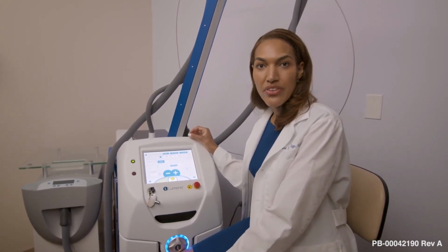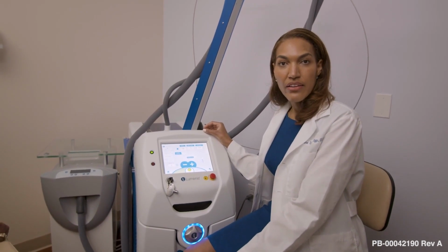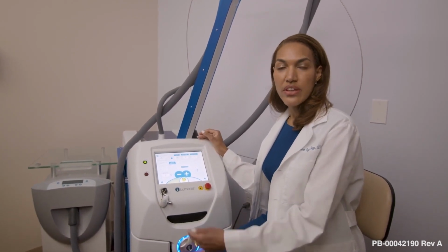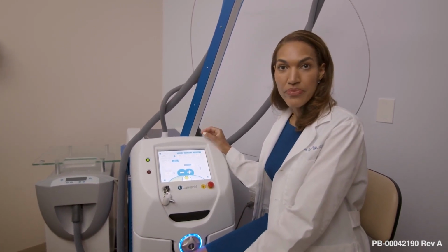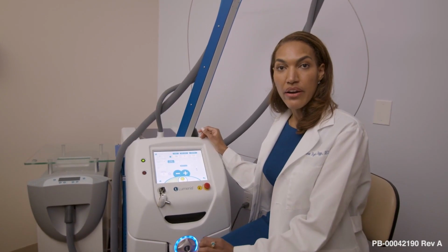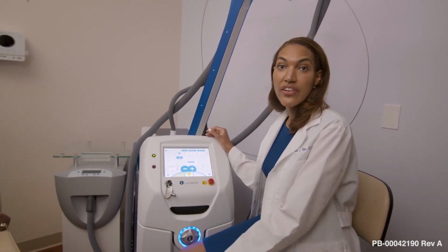So many times it can be difficult to see inflammation in the skin of someone of color. So you're really not looking for a lot of redness. If you don't see that, that is okay. Start with this parameter and then move up slowly. With time, as you get more comfortable, then you can start to increase the energy levels as the hair starts to change. So over time, with each treatment, you see results. The hair will grow more slowly. It will grow finer, more like arm hair. And you'll see areas that have no hair at all. So you'll see areas where there's some persistence and areas where there's zero hair. So they have less hair overall.